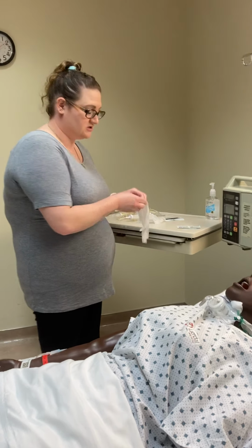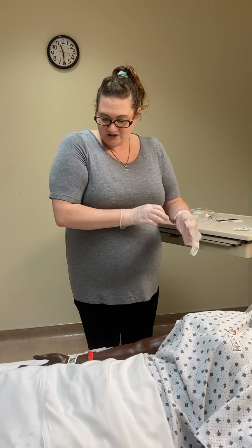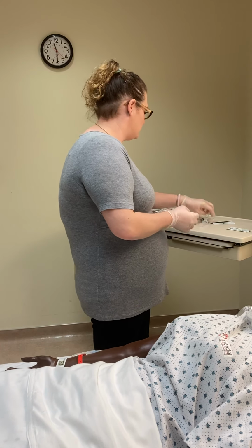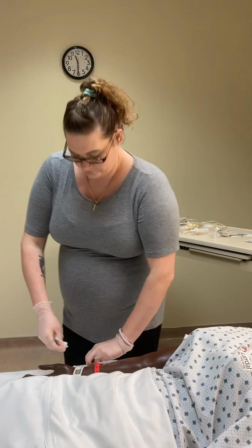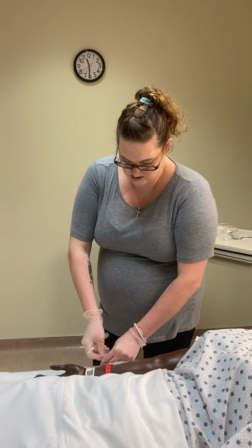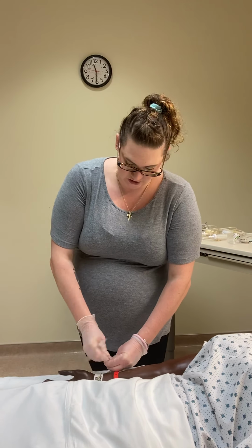Can you tell me your name and your date of birth? And she tells me, are there any allergies? No, she doesn't have any allergies. Have you ever had a transfusion? And she says, no, she has not. So I can explain to her things that I've discussed earlier in this video regarding why we want to replace it. She's obviously lost blood. That can have issues with circulation. So we want to make sure that we get the blood replenished.